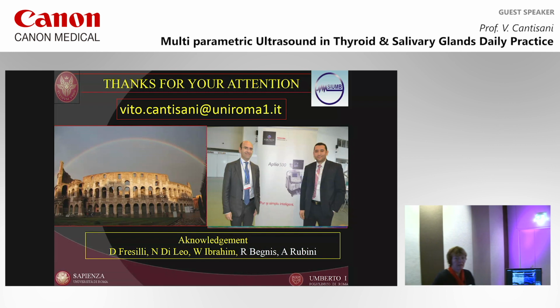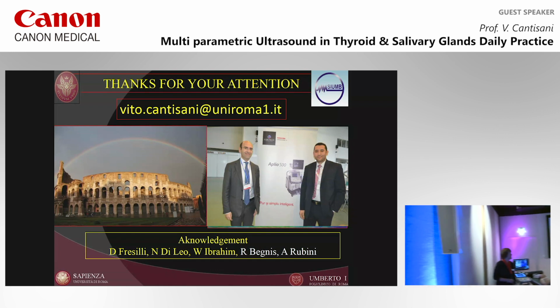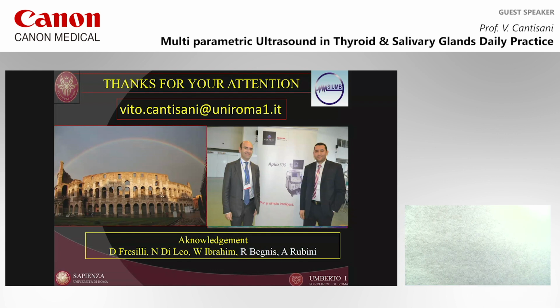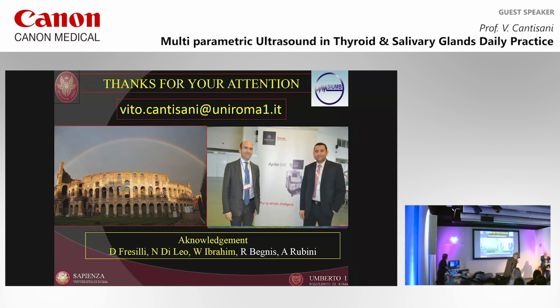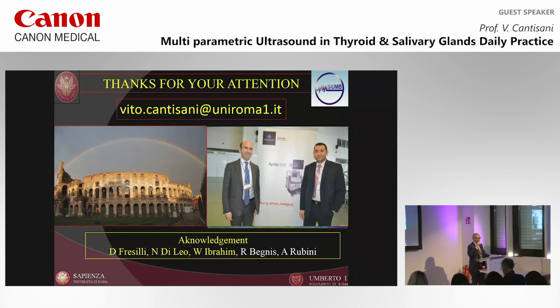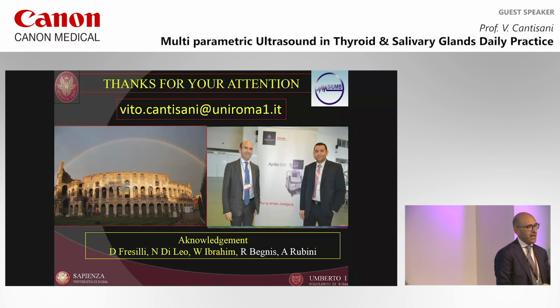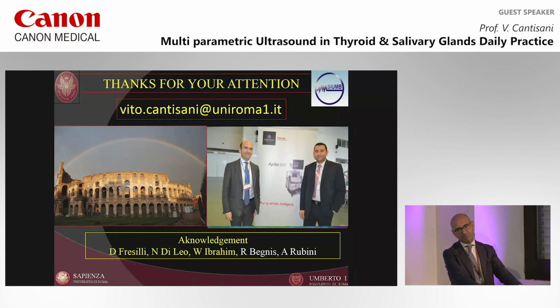I think it would be very difficult to evaluate the elastography and the outcome. I suggest not to use elasto. Okay, honestly, if you have a very worrisome lesion, elasto is an additional tool. You use it, but considering that it can give you some false positive results. If you have a lesion that is completely cystic, or grossly calcified, I don't recommend doing elasto. Totally agree with you. Never do it. Otherwise, you can have false positive results, or false negative.